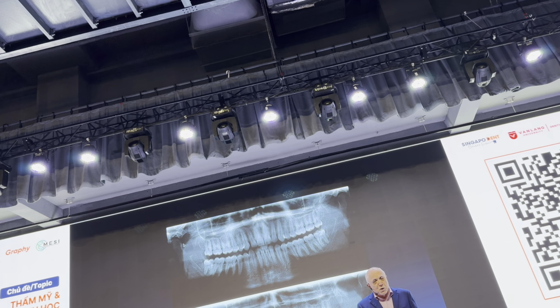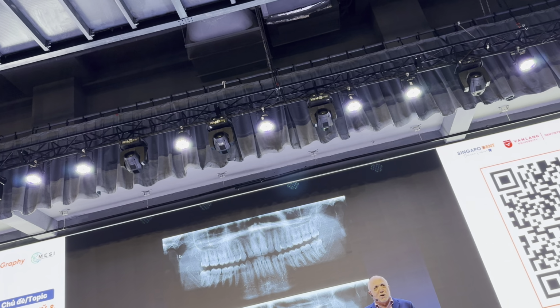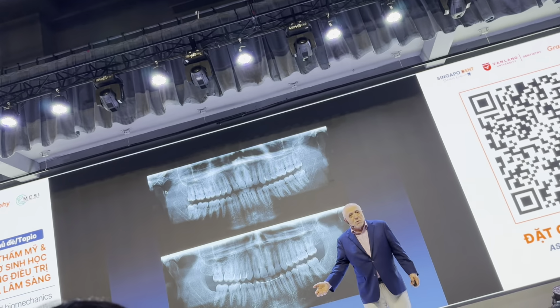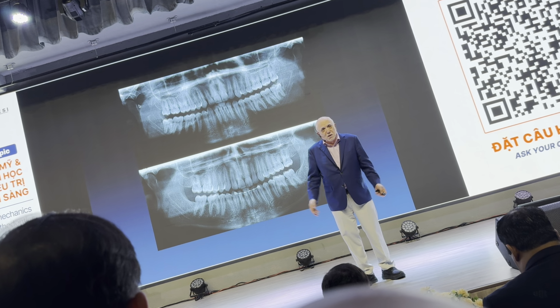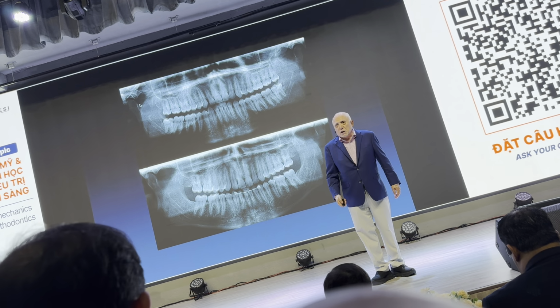Because now you can put the brackets again, you can look at the axial inclinations, you can finish the patient nicely. At the end of the treatment, you've already taken everything out. So it becomes just like a history. We can't use it for treatment.